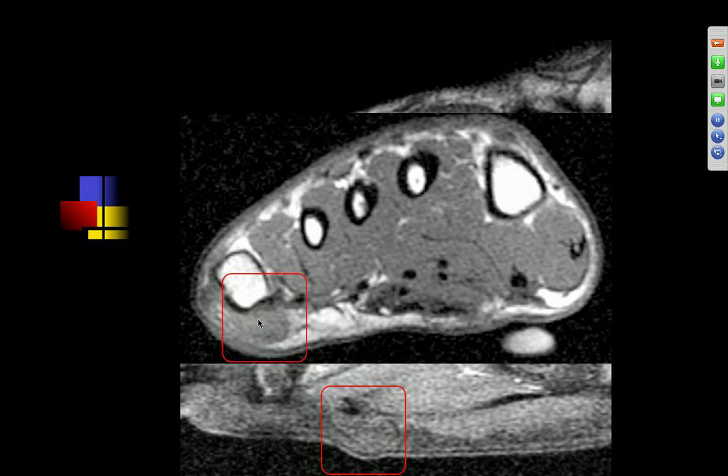These can be very, very painful lesions if any of you have had them, but they can also be completely asymptomatic. So you can't really differentiate whether they're symptomatic or not on MRI. You can just describe them, and typically the best way to determine whether they're significant or not is if the marker is over the lesion, then it's probably significant. If the marker is somewhere else, it's probably not. But just be aware of these.